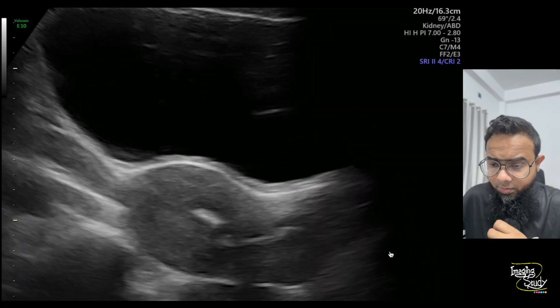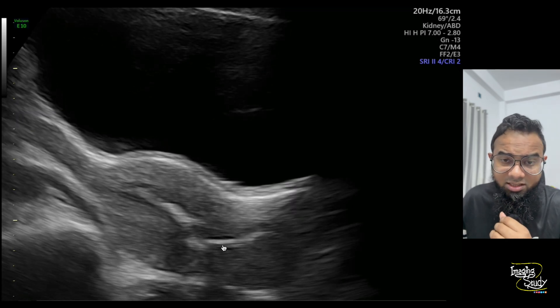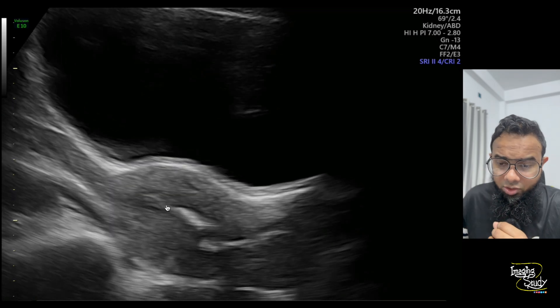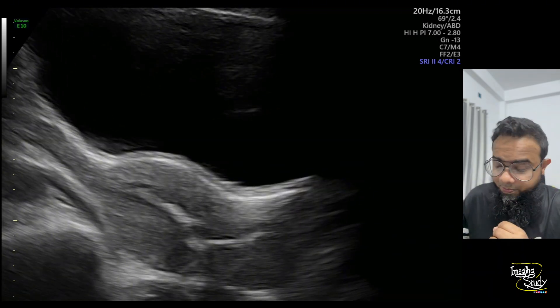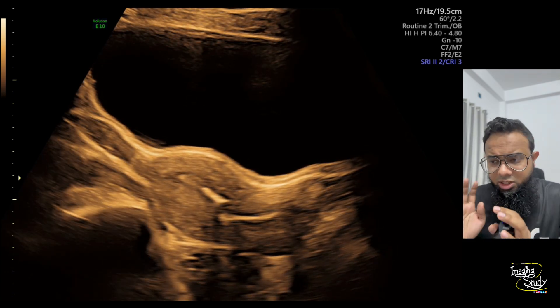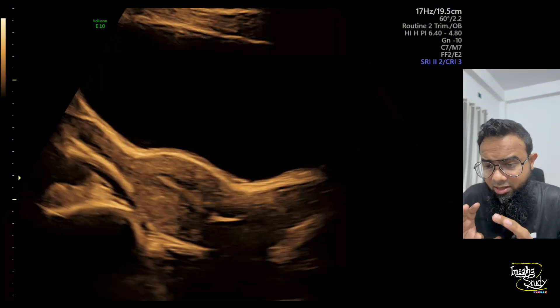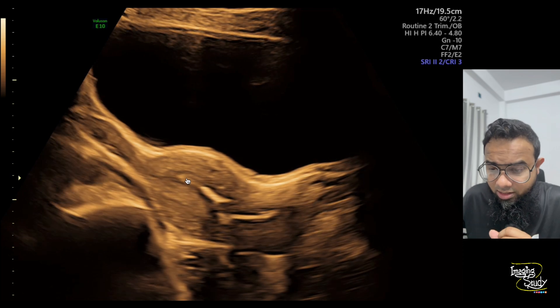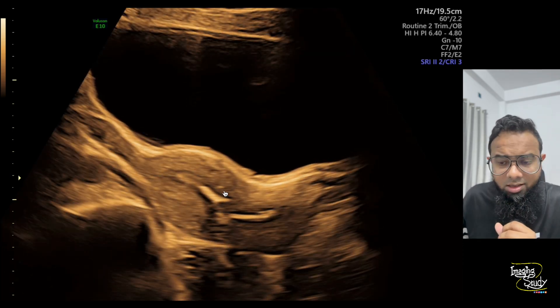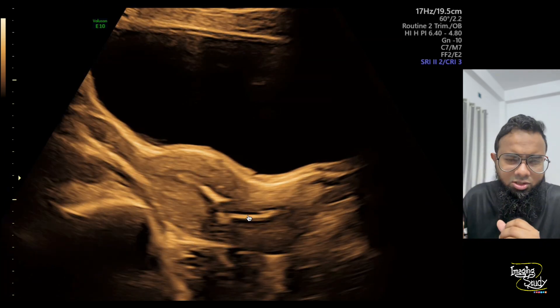Here's another longitudinal view, and you can still see the echogenic calcific plugs within the endometrium. This is the normal endometrium at the upper part of the uterine body. Here's another view with a different preset — using different presets helps you evaluate the lesions quite confidently. The calcific plugs are visible at the lower part of the uterine body and adjacent to the endocervical canal.